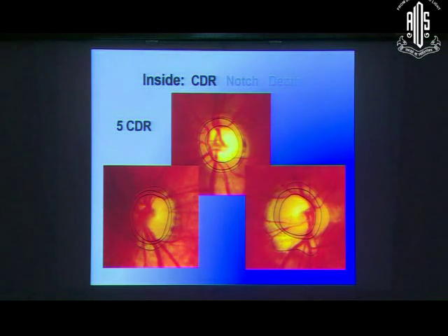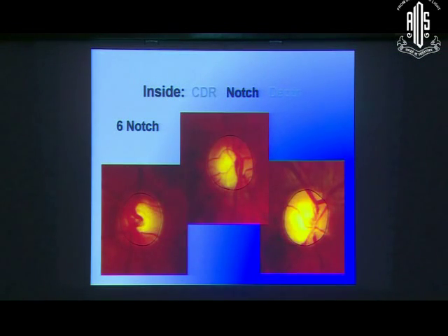So you have to go by the contour. There are different clues that we use while deciding where the neuroretinal rim is, and that is actually again a more error-prone area. So you go by the contour, not by the color. Basically you're using multiple cues when you are studying. You're looking at the color, the contour, and also the focus: which areas are sharply focused and which are not at a particular setting. Your brain puts all these clues together to come to a conclusion where the rim is. So this is again a skill which needs to be developed and needs time.